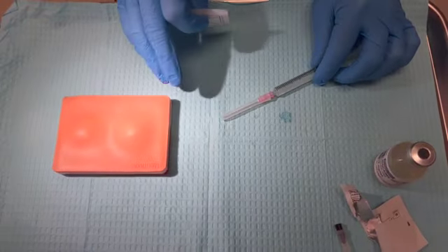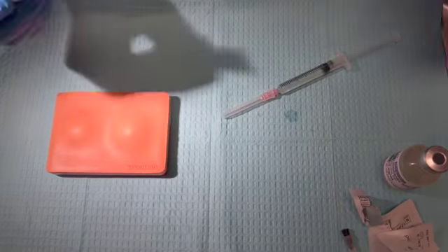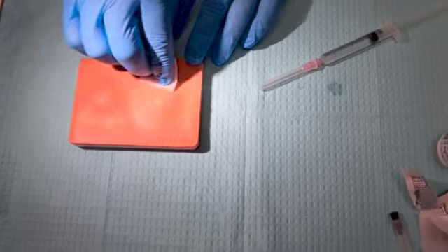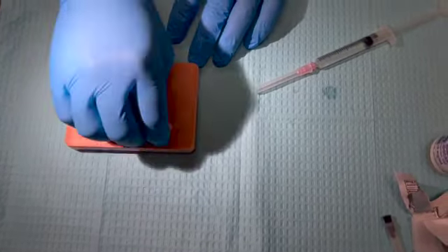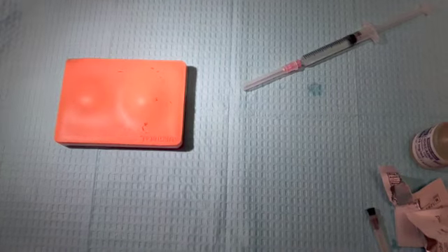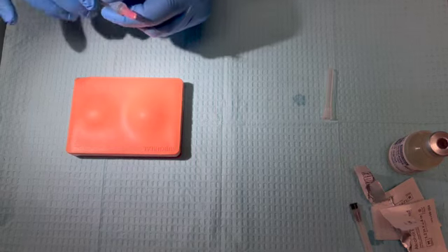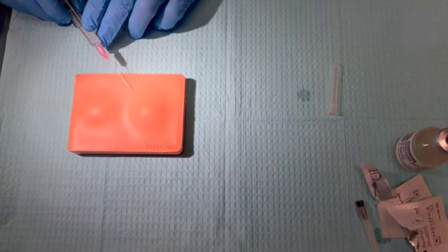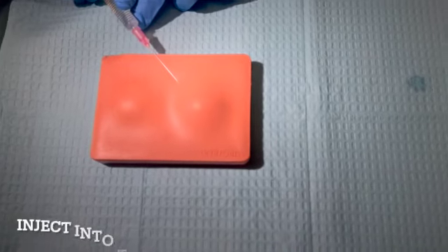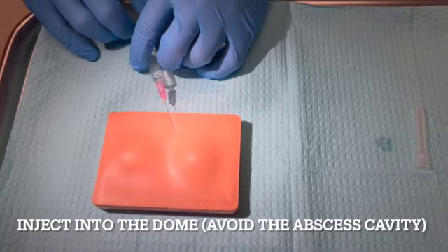Before I inject this into the area, I want to first prepare the skin, in this case with another alcohol pad. I'll clean the area, the skin, and again, we want to allow for drying of that alcohol prior to injecting that medicine. Now that we have prepared the skin with alcohol, I'll go ahead with bevel up, and we want to come in very superficially into the area, being mindful not to inject the medication into the abscess cavity itself.